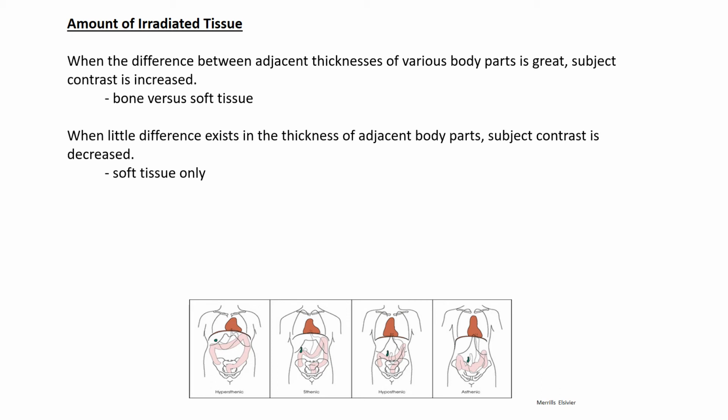Even in the abdomen, if we took away the bones, for example, took away the gas, for example, what would you have? You'd have a lot of grays, right? A lot of grays, and some of these grays would be so subtle they'd kind of be blending in with the other grays, and you wouldn't see very much. That too then would be a lower subject contrast.